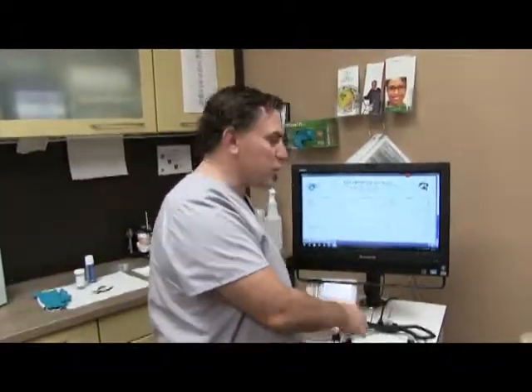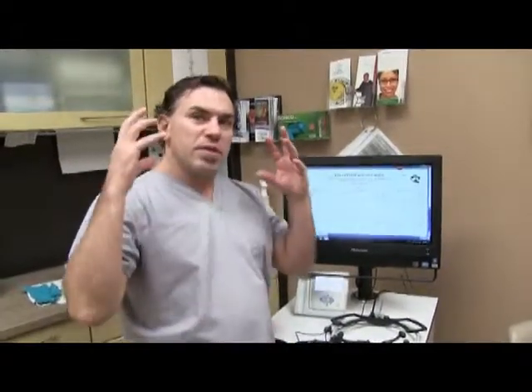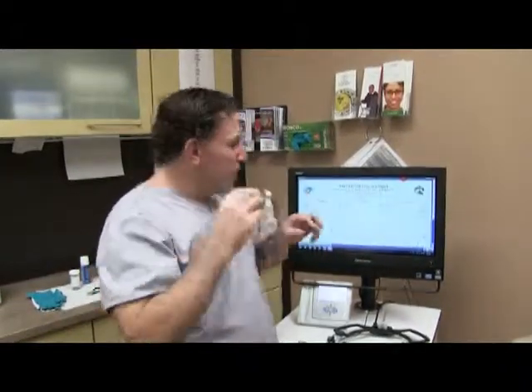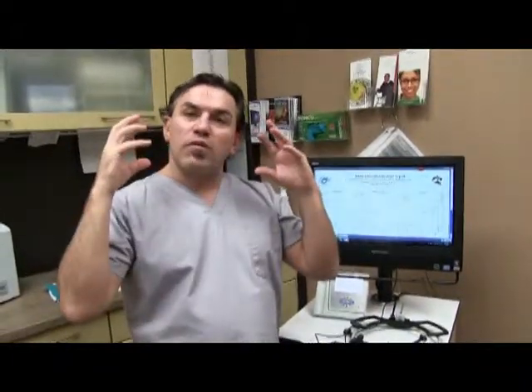The jaw movement shows up on our screen, as you can see here, with the protarticulation report. It identifies the movements of our natural movements — our right condyle independently to the left — and gives us an actual computer-generated record of that. Using those records, the benefit is that we can set an articulator, an artificial jaw, and program the movements of the patient to identify natural parameter functions.